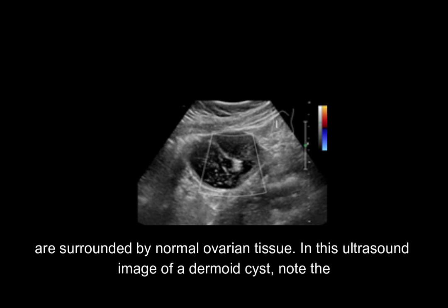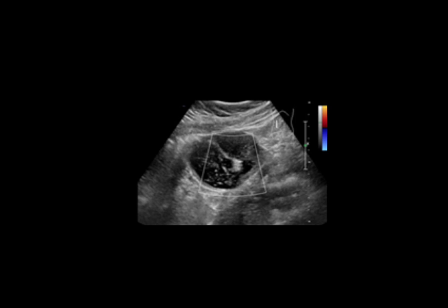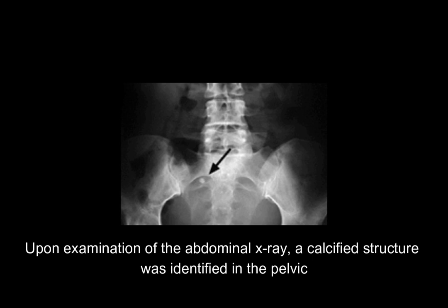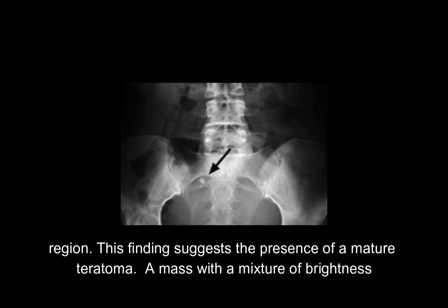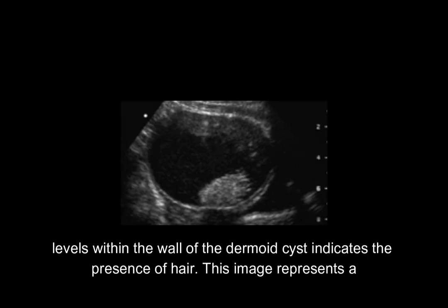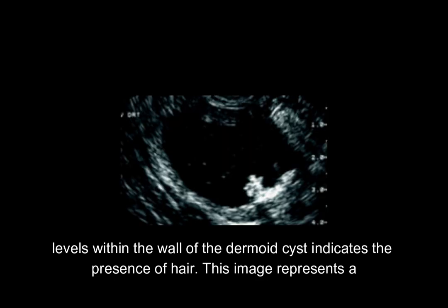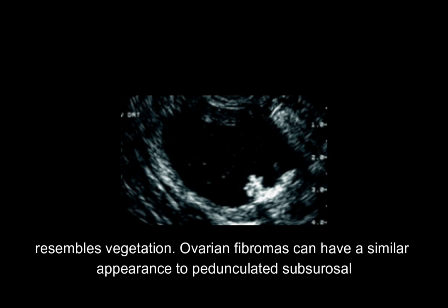In this ultrasound image of a dermoid cyst, note the calcifications which suggest bone. The echogenic lines and dots represent acoustic shadowing. Upon examination of the abdominal x-ray, a calcified structure was identified in the pelvic region, suggesting the presence of a mature teratoma. A mass with a mixture of brightness levels within the wall of the dermoid cyst indicates the presence of hair. This image represents a mature teratoma, dermoid cyst, with characteristics of a Rokitansky protuberance, a finding that resembles vegetation.